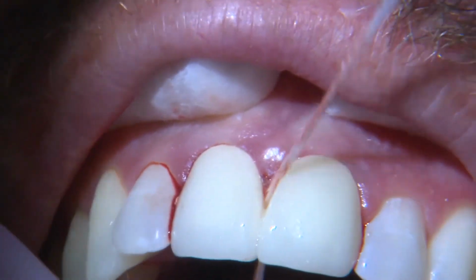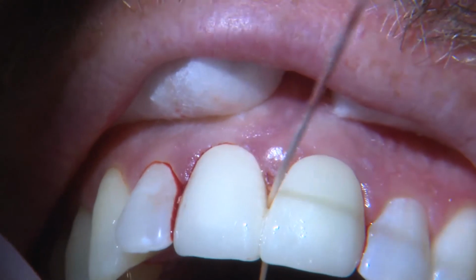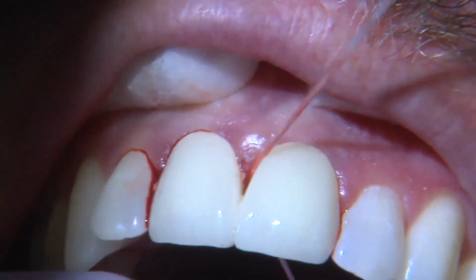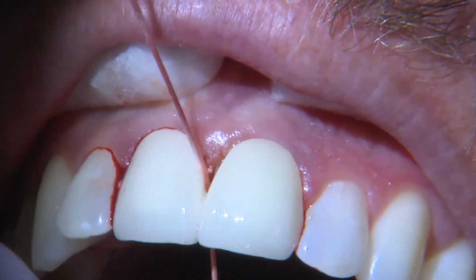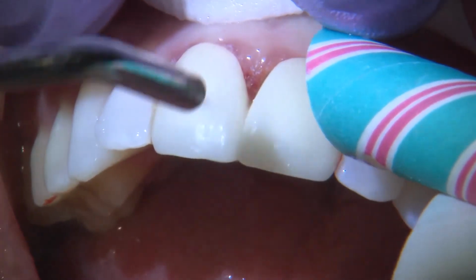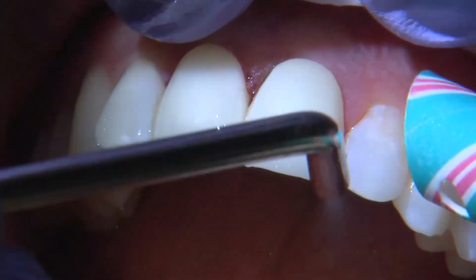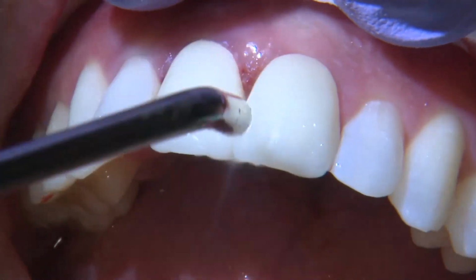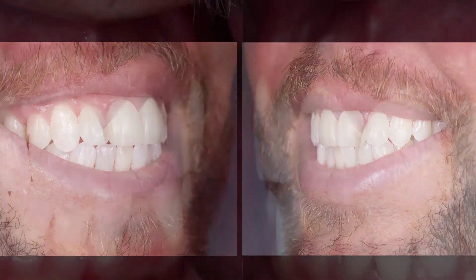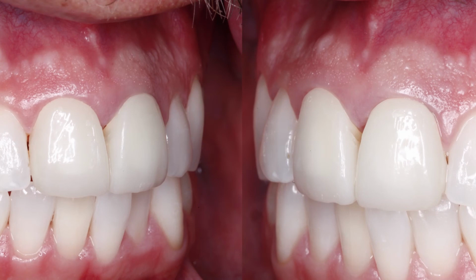And what I like to do is also give a package of super floss to the patient, because it's really important for him to clean this area while the tissue is healing and while the lab is going to fabricate the final restorations. So there you have the BioTemps in place, and within a week the patient comes back for some pictures, and you can appreciate how the soft tissue has already healed, and then we can move to the next step in the selection and fabrication of our final restoration.